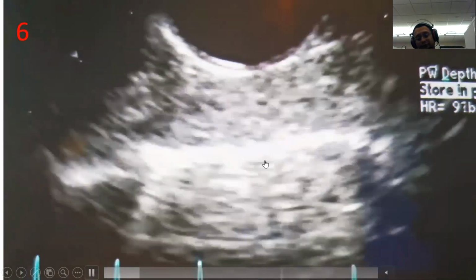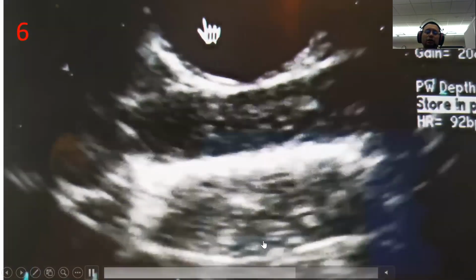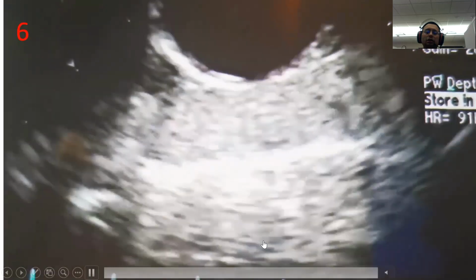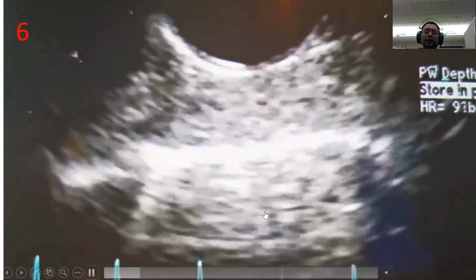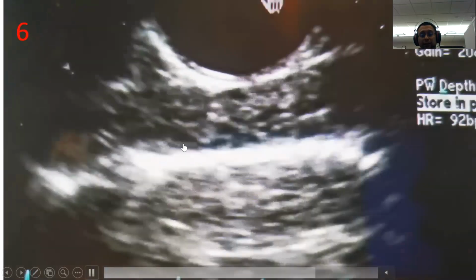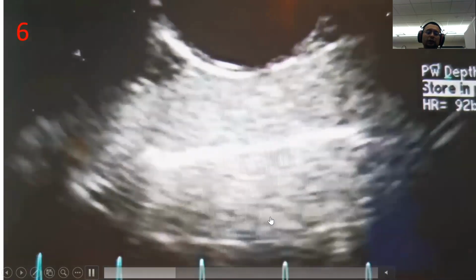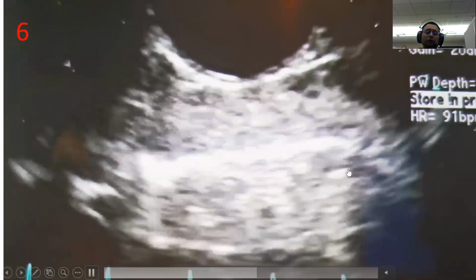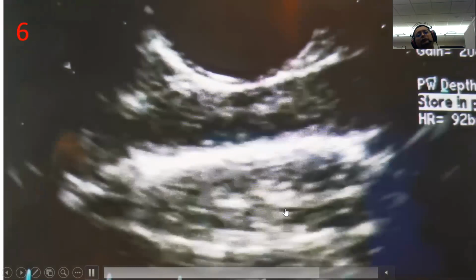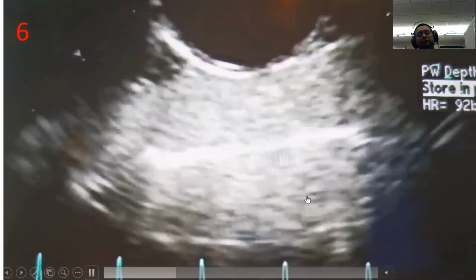Ceiling? Not sure. Sarah, pardon? Yeah. This is at what level? I mean, upper esophageal. Just I tell you, this is SVC, and what is this? Does this top one and down one look the same or not the same? Same. Look the same. So if this is SVC, what is this? IVC.